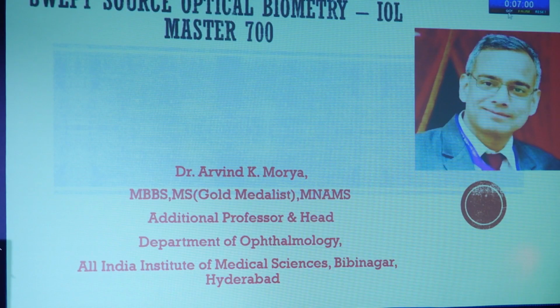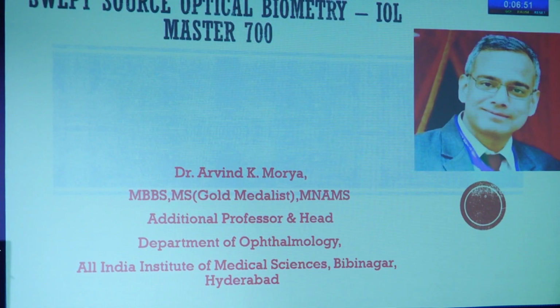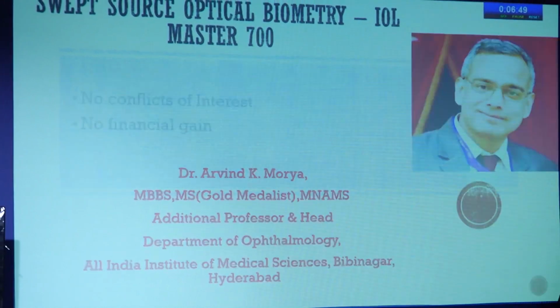Good morning, everyone, and thank you so very much for giving me the opportunity. So my talk is on swept source optical biometry on the IOL Master 700.